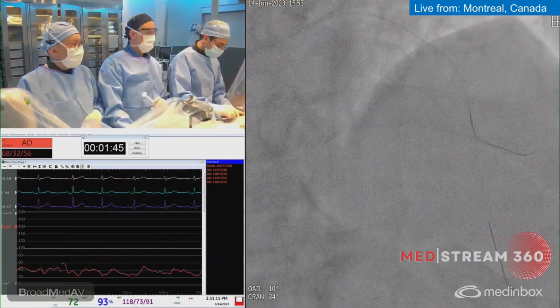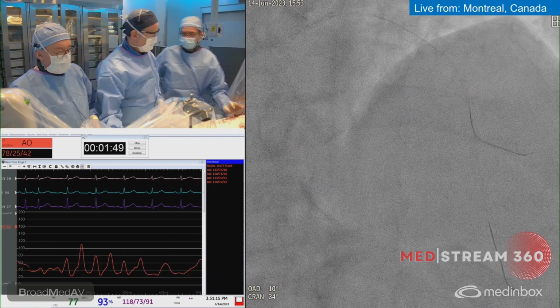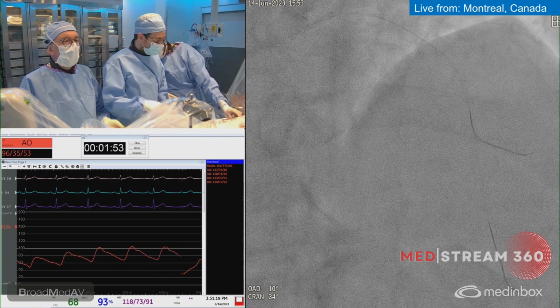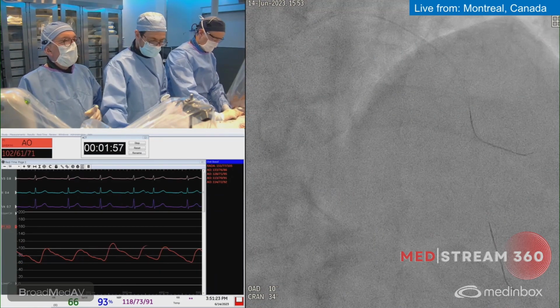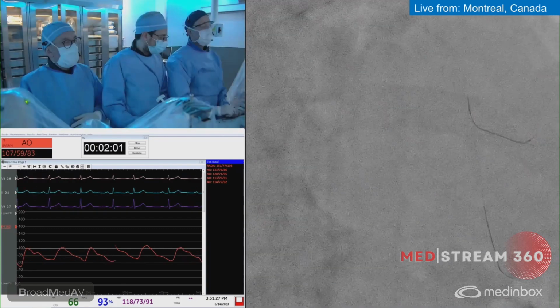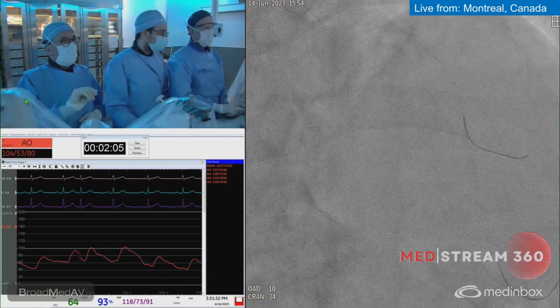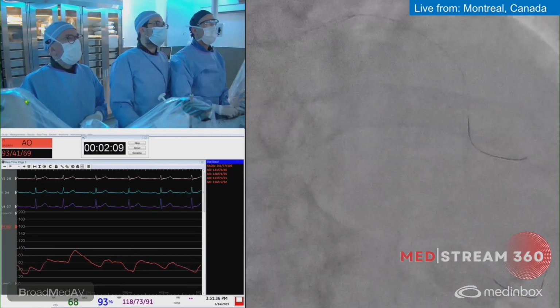Okay, maybe it's not going. Let me try. It's a short one. Yeah, try and leave it neutral. The wires were not crossed, obviously. That's another thing. I'm very careful when I just do 180 degrees, not to, how can I say, loop my wires.